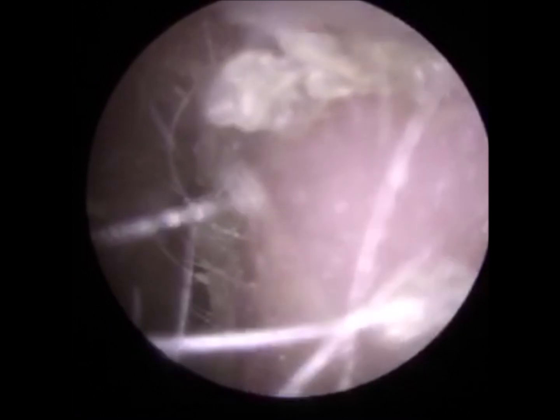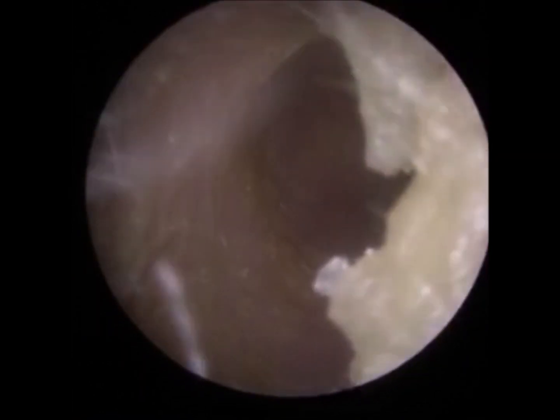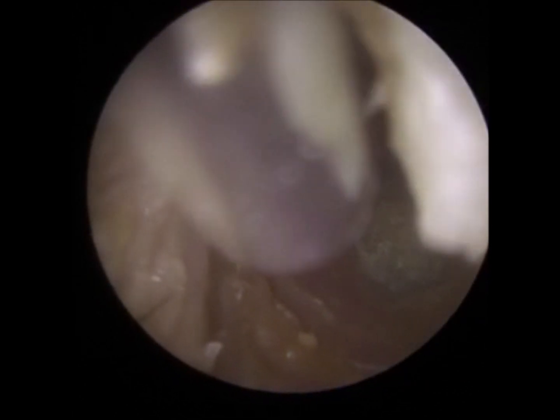You have to stay very, very still for me as we're going very deep in your ear. I'm going to stretch your ear at the entrance because it's very inflamed. Your ear canal comes quite long as well. I've got it all recorded so it'll show exactly what I'm doing.